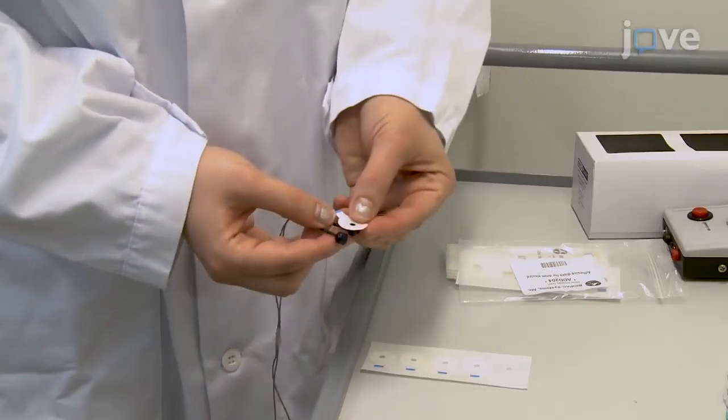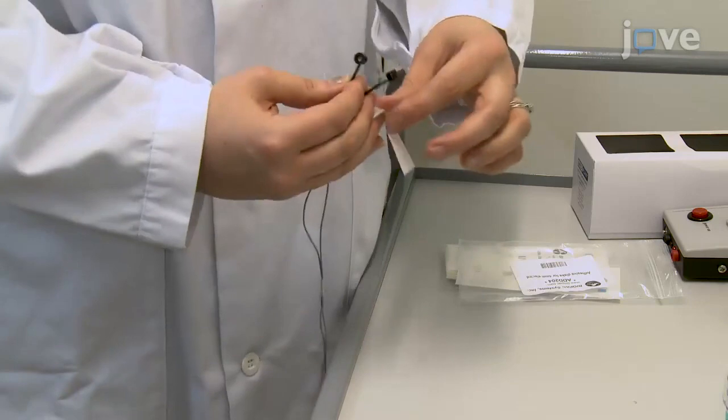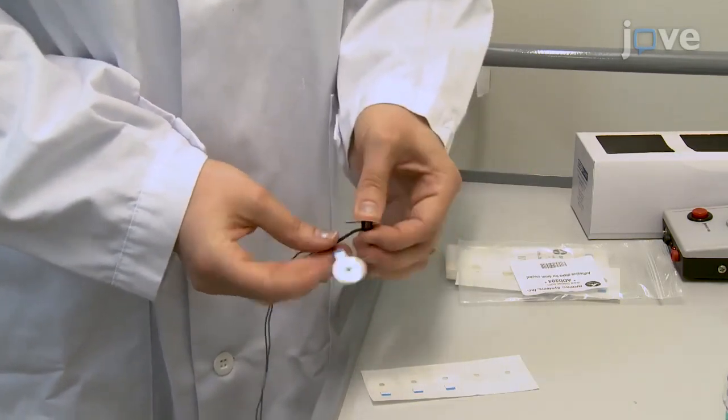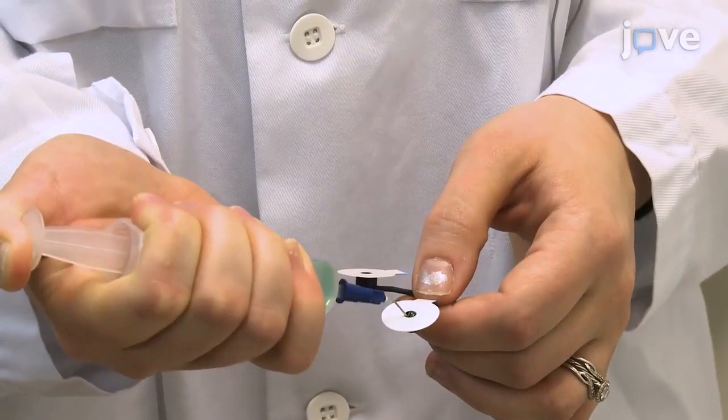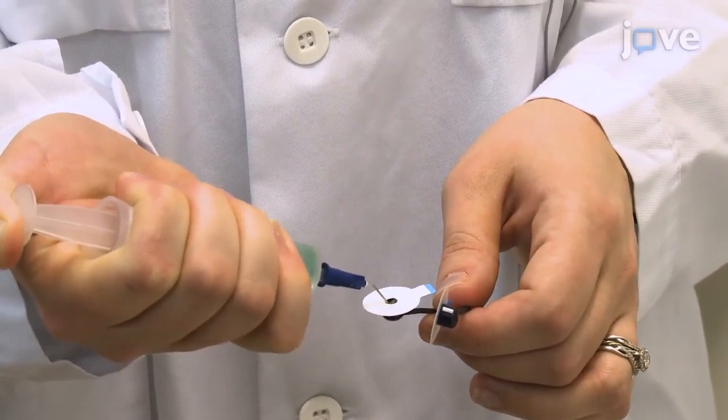Next, apply adhesive collars to the electrode pairs consisting of two 4mm shielded bipolar recording electrodes plus one monopolar reference electrode so that they adhere to the skin. After the collars adhere to the outer rim of the electrodes, fill sensors with a conductive electrode gel, taking care to prevent the formation of air bubbles.